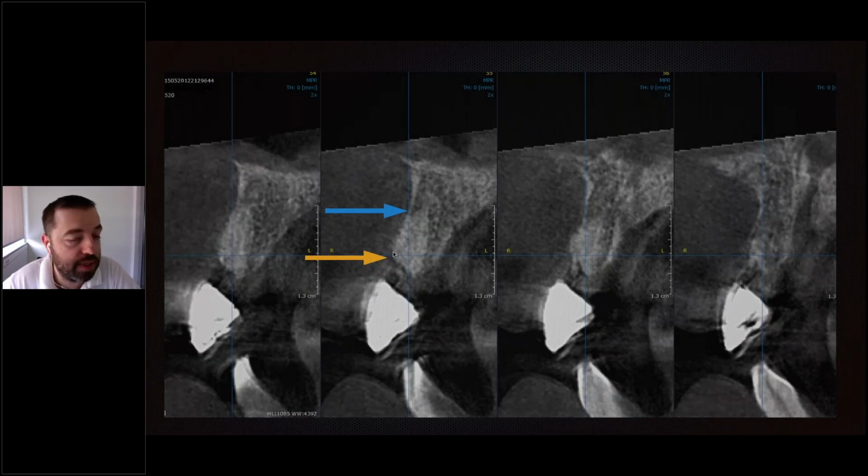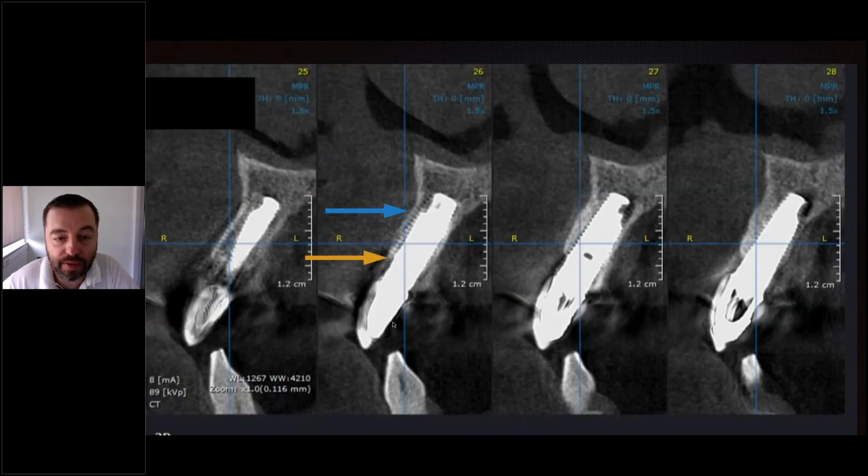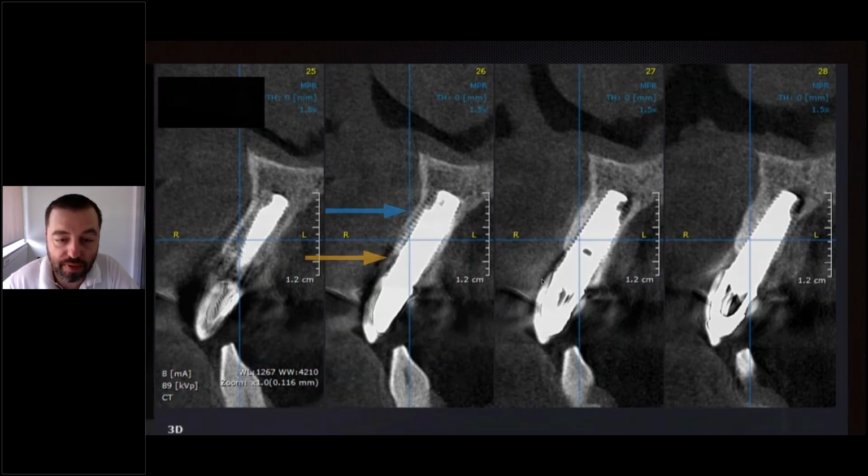Now this is again after 6 months after the implant placement, and the implant is already integrated. You can see the provisional crown, note that there is a space between the provisional crown and the implant, so it was not connected to the implant. And again, after 1 year of crown in service, we can see that we have the bone remaining up to the last thread. So here is a biological width distance that is usually generated by the tissue level implants.